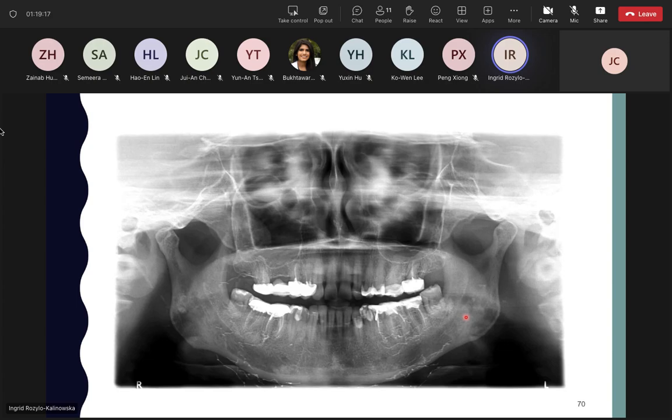And because of these lines that appeared in the resultant radiograph, we really thought that this had been the fault of the so-called intensifying screens in the cassette, that they were dirty, so the radiographer cleaned them, wiped them, and the radiograph had to be retaken. And it was very, very surprising that the second radiograph was identical.